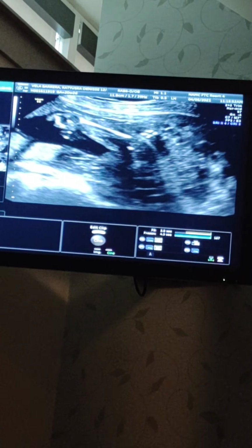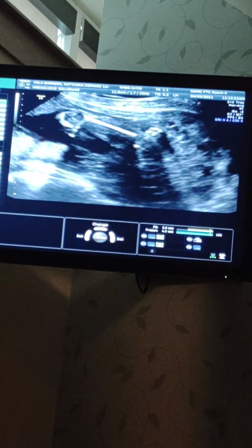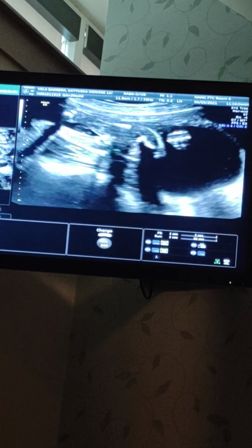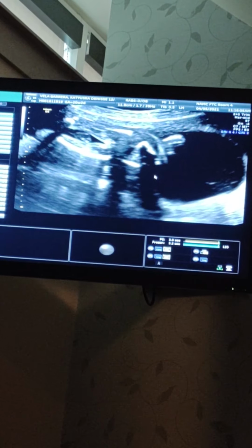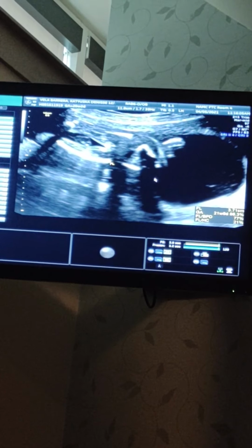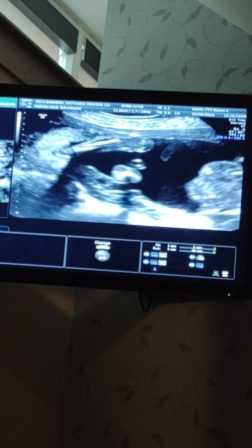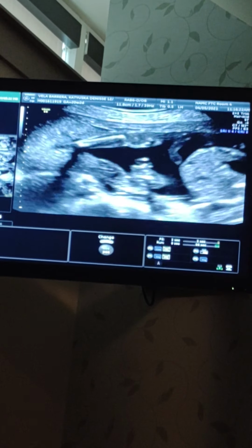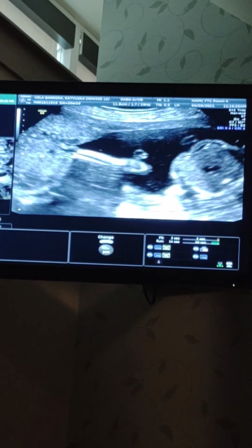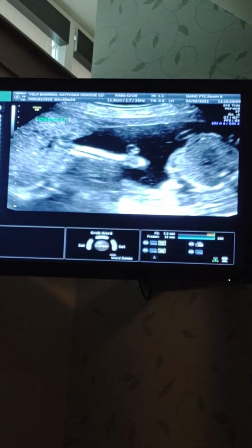So let's look at the legs here. That's a femur. That's the thigh bone. Let's get the other side here if we can. The opposite femur. This is the right one. The top one was the left. Let's see where the lower legs are. They're probably folded up here somewhere. Here we go. There's one. There's the other. This would be the right one. Lower extremity right.